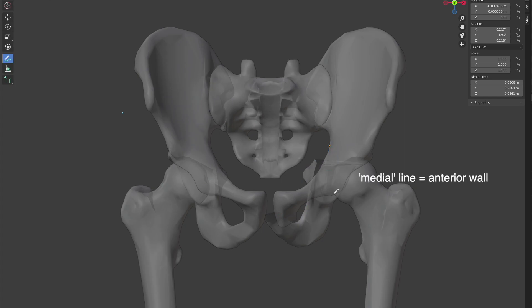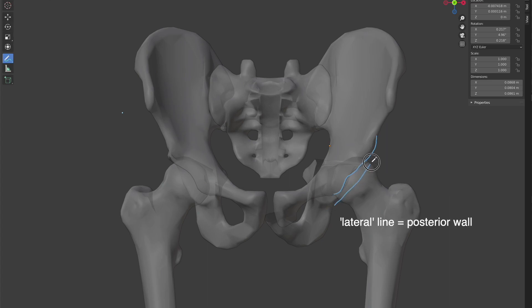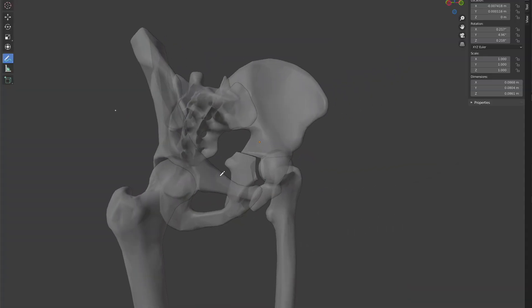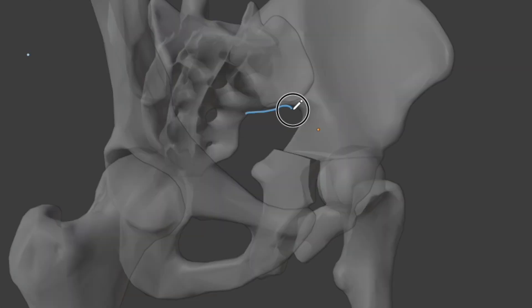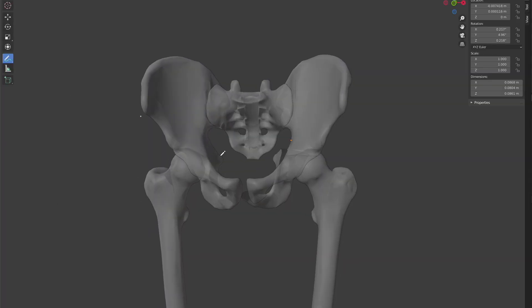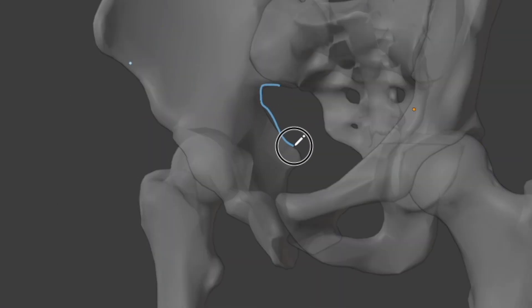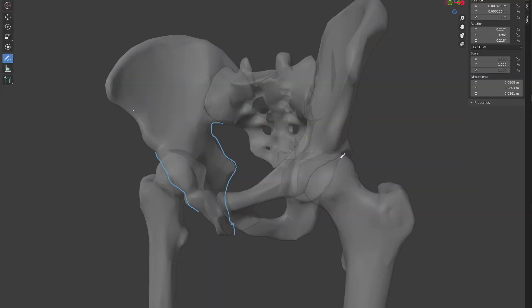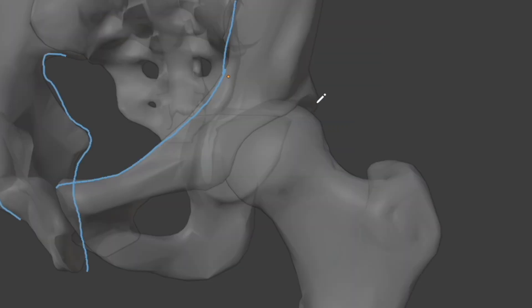Looking at the remaining lines on the left: the anterior wall appears smooth, but the posterior wall cannot be clearly identified — and its displacement suggests the posterior column has moved, since the posterior wall is part of the posterior column. On the right Judet oblique iliac view, there is a very sharp angle indicating a fracture of the posterior column, while the anterior wall is fine. The oblique obturator view shows the anterior column is smooth and the posterior wall is intact. On the left Judet view, the posterior column line is undisrupted, the anterior wall is smooth, and the anterior column is unaffected. However, the posterior wall appears displaced from the top of the acetabulum, confirming it has moved along with the posterior column.